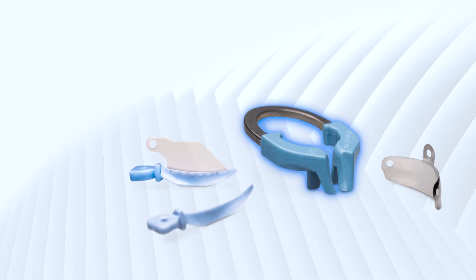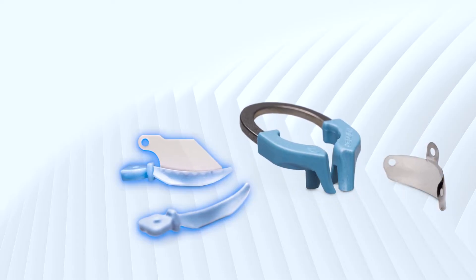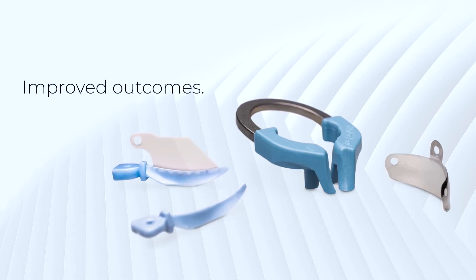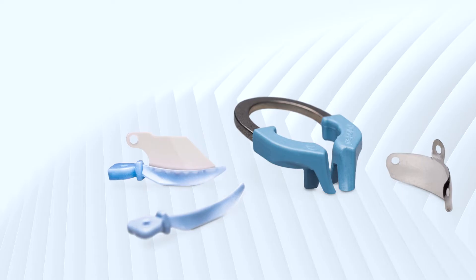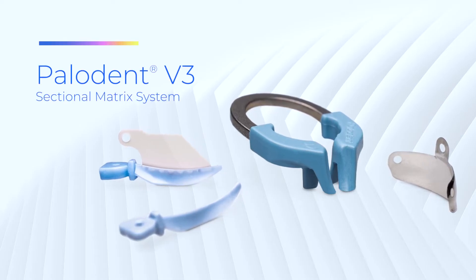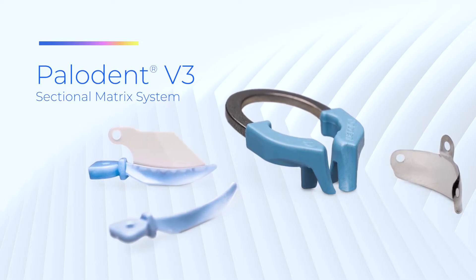Its nickel titanium rings, anatomically shaped matrix bands, and adaptive self-guiding wedges enable the clinician to deliver improved outcomes even when faced with wide cavities and missing cusps. Used in tens of thousands of dental offices and schools globally, better dentistry starts with Palodent V3.